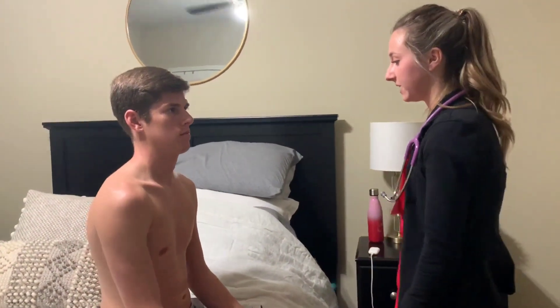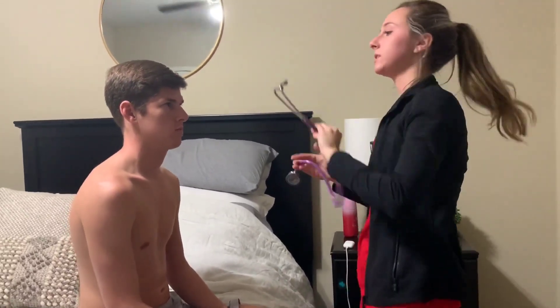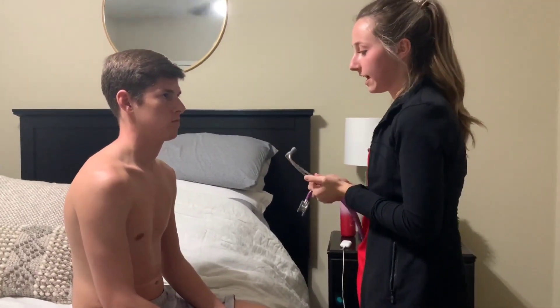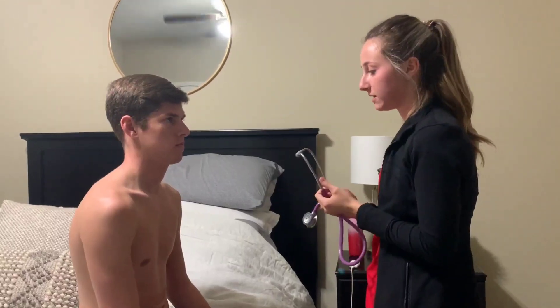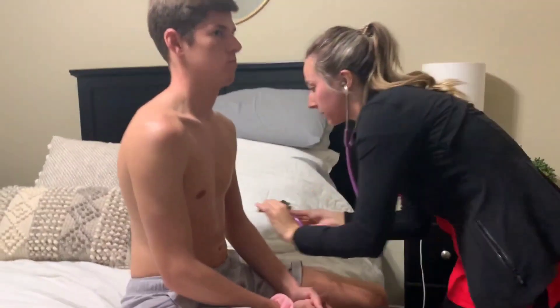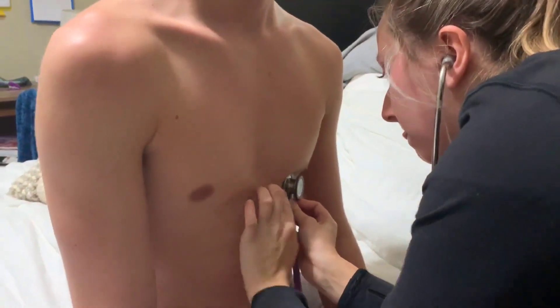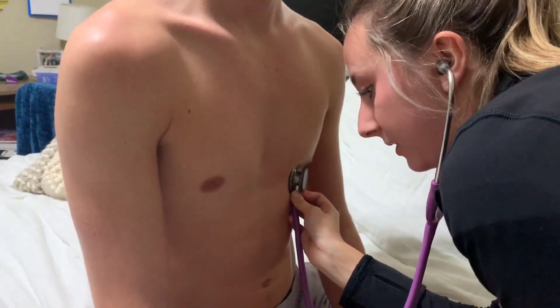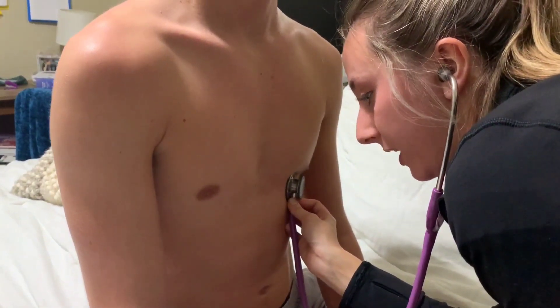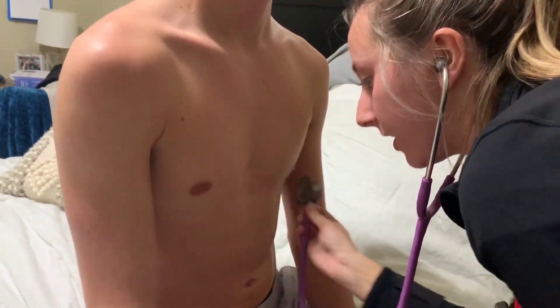I didn't see any heaves or feel any thrills, so that's good. Next we're going to do the apical impulse — listening at the fourth or fifth intercostal space at the mid-clavicular line. We'd count for a full minute; we'd want it to be between 60 and 100 and regular.